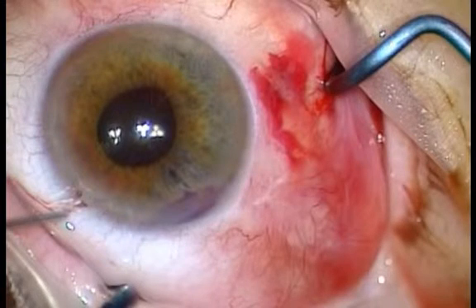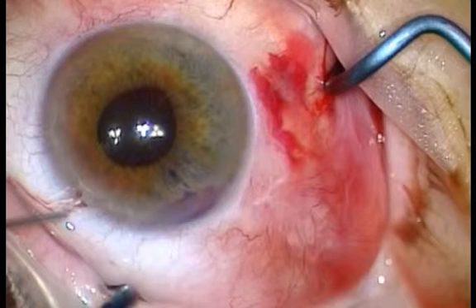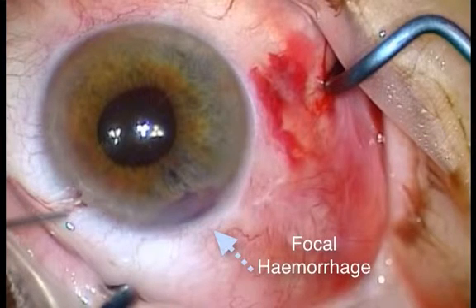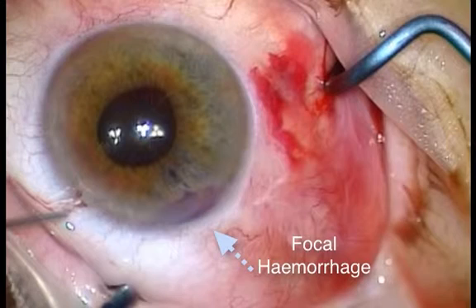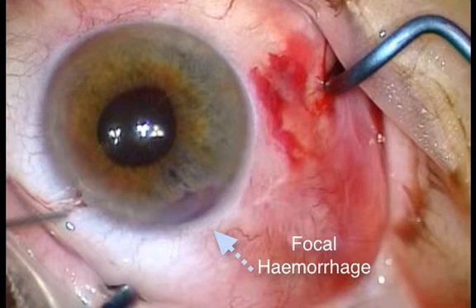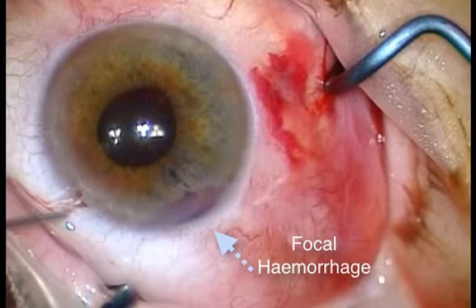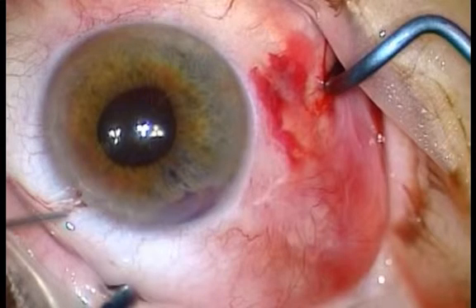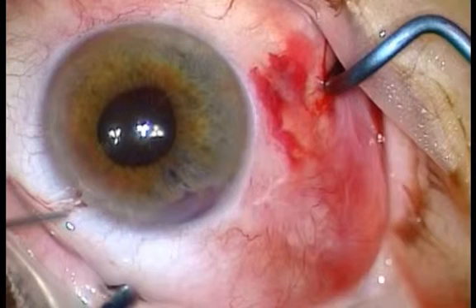During the process of disinserting the iris from the corneal section, one can see a small area of hemorrhage adjacent to the corneal section, where there has been focal induced angle trauma at the iris root.